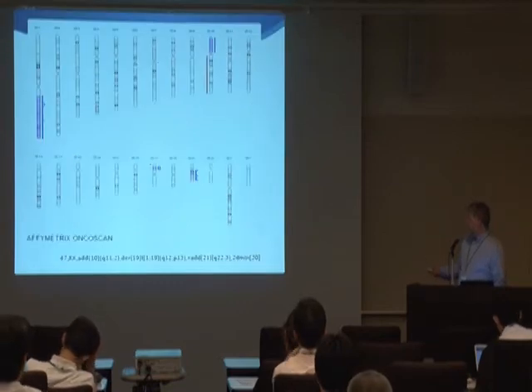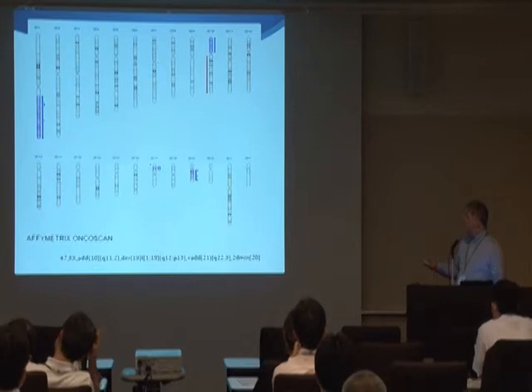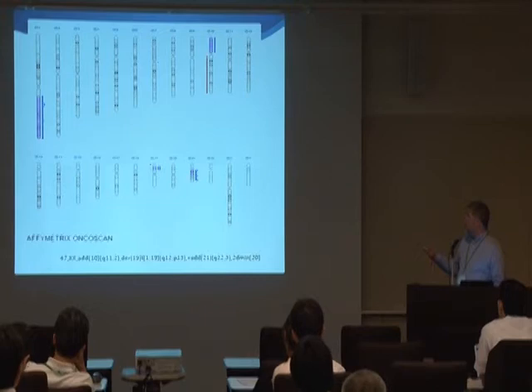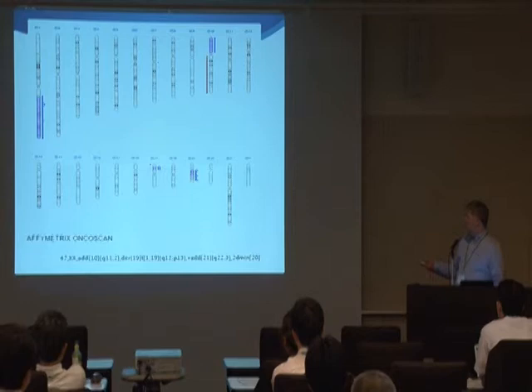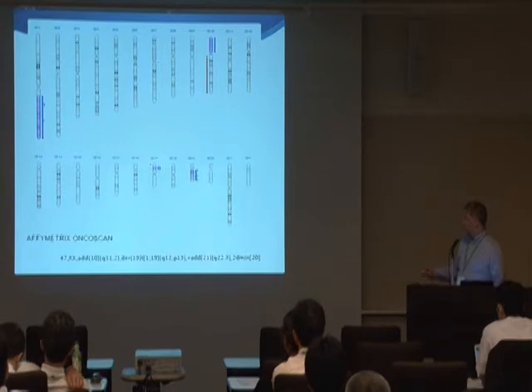And so again, when we looked at that using OncoScan, we could see that we were replicating all of these abnormalities very well. We could see that almost all of chromosome 10q was missing, matching almost exactly what we saw in the metaphase cytogenetics with additional material of chromosome 10p, and both losses and gains on chromosome 19 and high amplification of chromosome 21, which probably contained a lot of the material from the add(21).